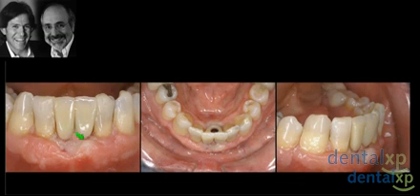From an aesthetic standpoint, obviously, on insertion, you can see that this little piece of artificial composite resin for the pink interface occurs right here on a flat ridge. We have a screw retention capability, so we can always gain access to this area, and you can see again the importance for the surgeon to build out the buccolingual aspect and not to be concerned as much about the vertical aspect of the interdental papilla.